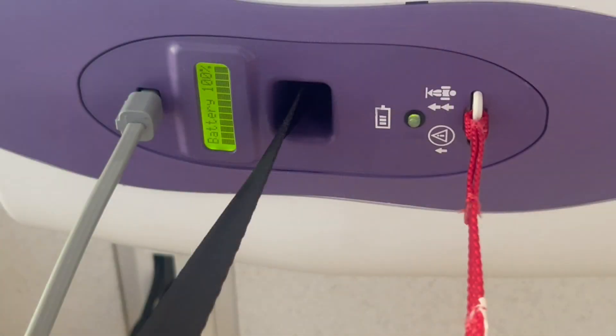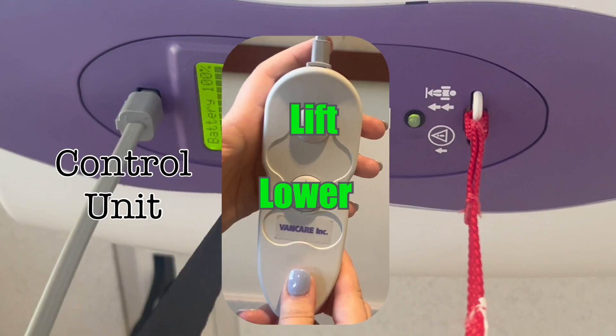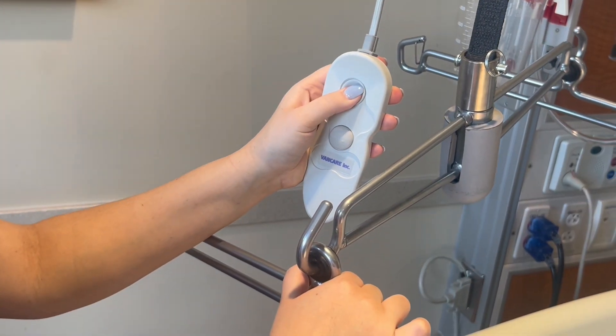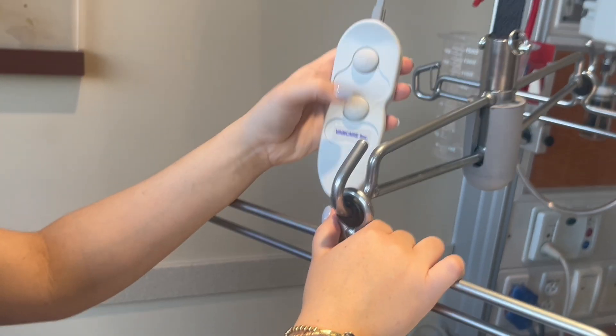If you look up at the lift, you'll be able to see a few features of this machine. The gray cord on one side of the lift attaches to the control unit. The control unit has buttons to lift and lower the patient. To use the controls, you have to hold down the button while the lift moves up or down, then release the button when the patient is at the desired height. The unit is pneumatic, not electric, so it is safe to clean thoroughly after use.